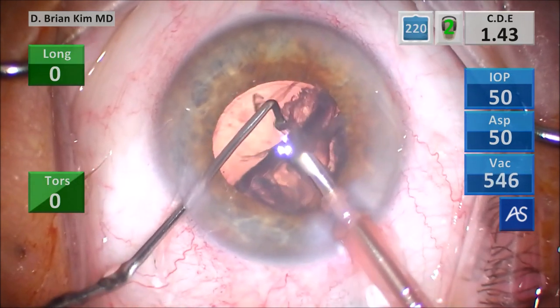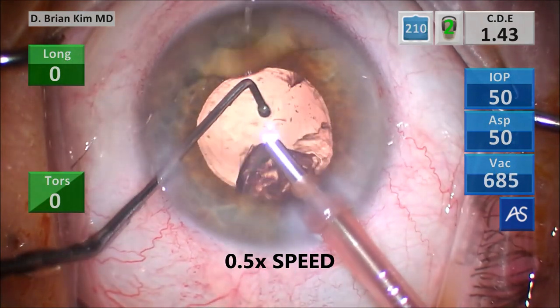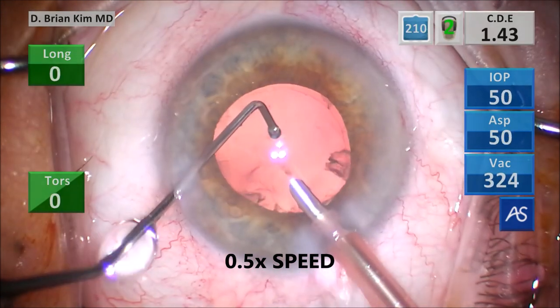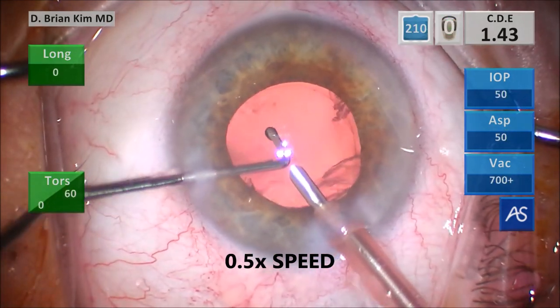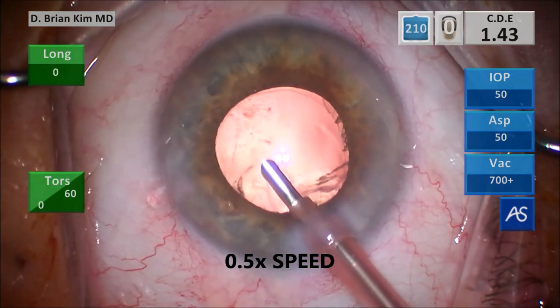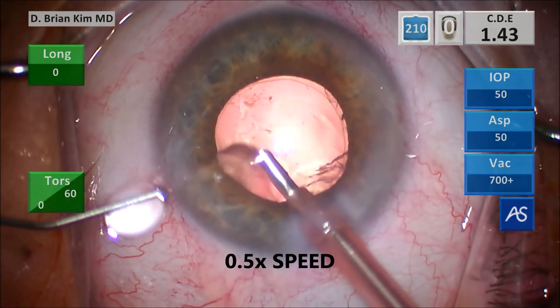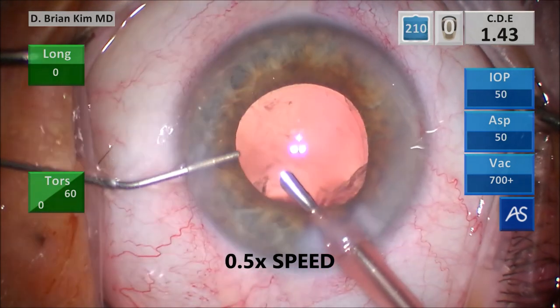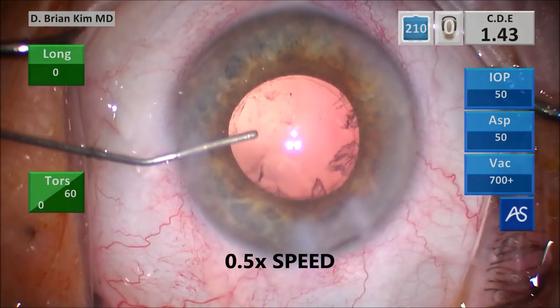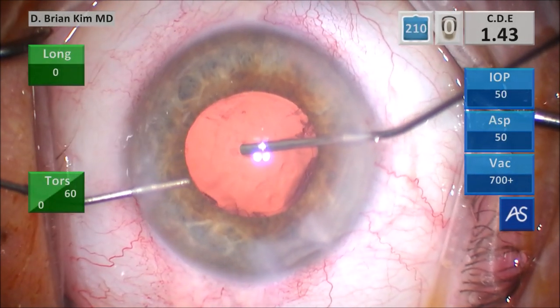In retrospect, I could have hooked the epinucleus up with the chopper away from the capsule — that would have been a better technique. But I think this was bad luck; I've done this maneuver in the past and it hasn't caused a problem. When you're dealing with cataract surgery, things do happen. Even though I grabbed the epinucleus, it was very thick and firm and didn't want to collapse into the phaco tip, so it tore the posterior capsule right in that corner. I never let the chamber collapse — and this is a good habit.